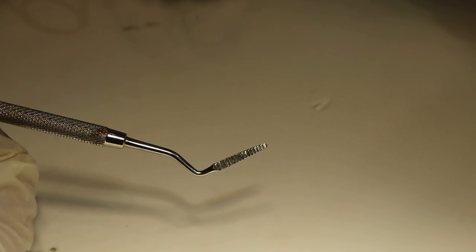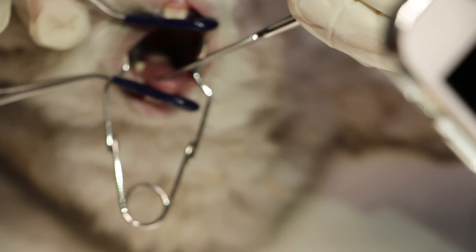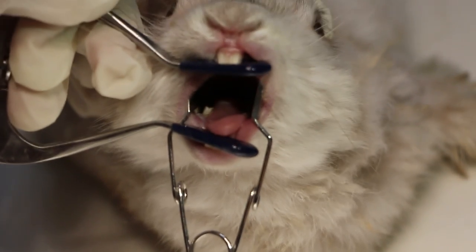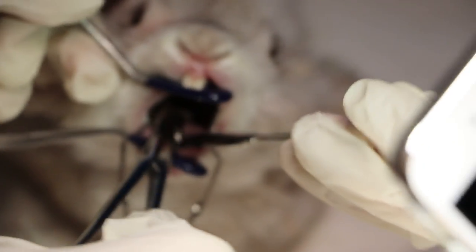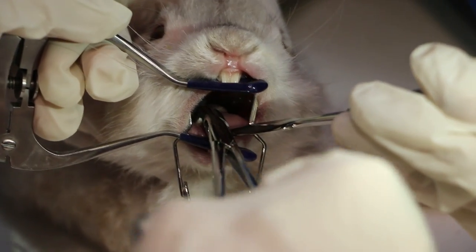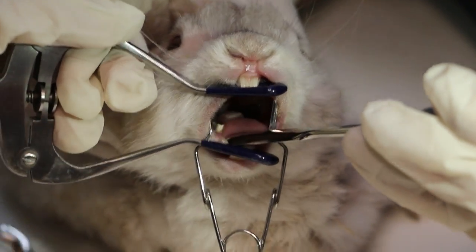Put it on the table — that's the filing instrument. After loosening with the luxator, or if there is a loose tooth, you will use the tooth extractor. With the forceps you grip the tooth and pull out the loose tooth. All the teeth are in good condition in this rabbit, so this is just a demonstration.